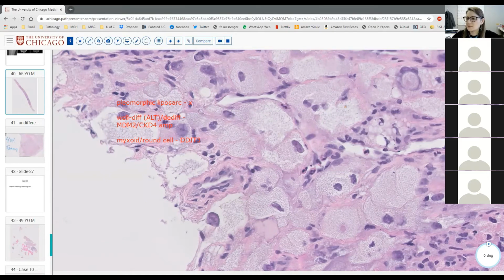Okay, Heather Smith, tell us about the morphology of pleomorphic lipoblast. For any lipoblast, I would expect to see fat vacuoles that are actually indenting the nucleus, and I don't really see that here. I just see big ugly nuclei with big ugly pseudo-inclusions, not the indentation of the nucleus by fat vacuoles that you would expect for a true lipoblast.